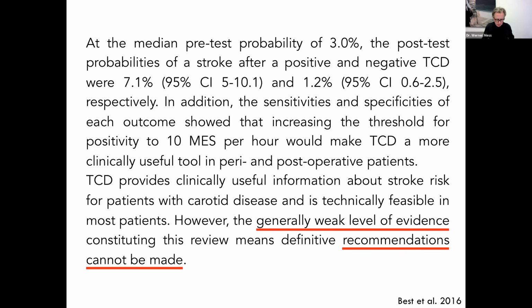This is a problem we encounter regularly in embolus detection, that the quality or the scale of the studies doesn't fulfill strict criteria for definite recommendations. But the fact that we do not have evidence-based recommendations here doesn't mean that it makes no sense or that you shouldn't do it.